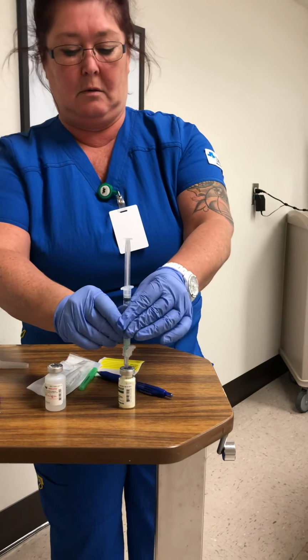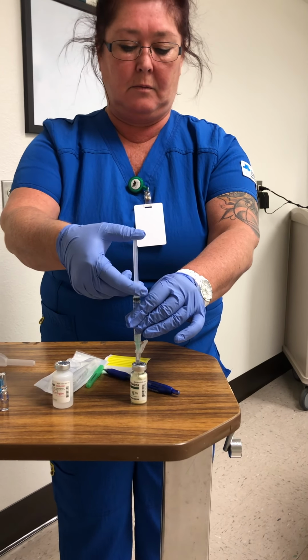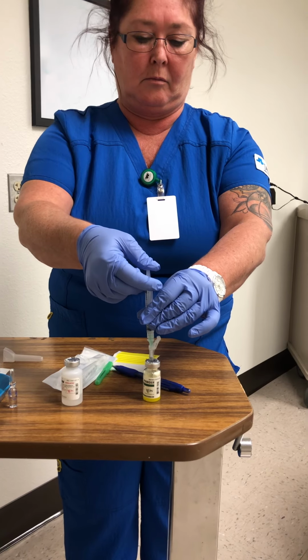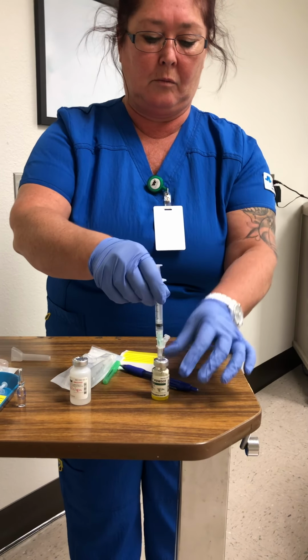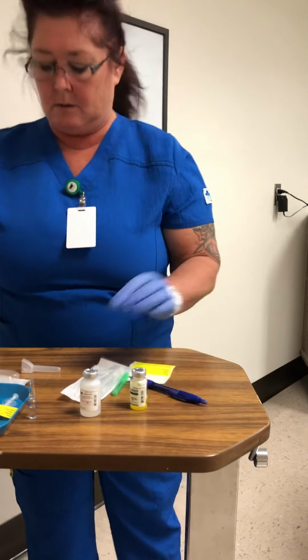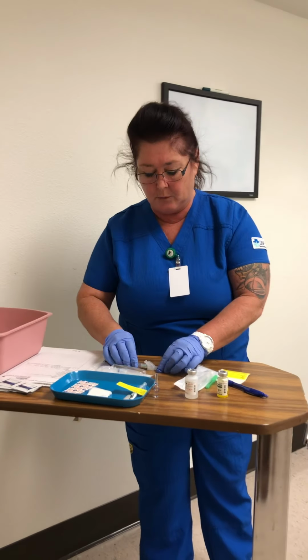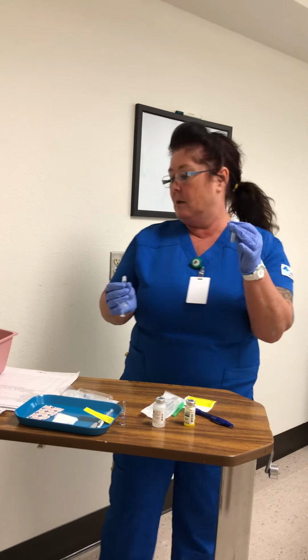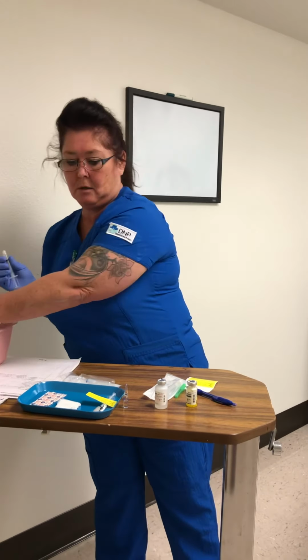I am now going to put this into my ceftriaxone. Pulling this out. I would recap. I'm going to dispose of this needle into a sharps container.